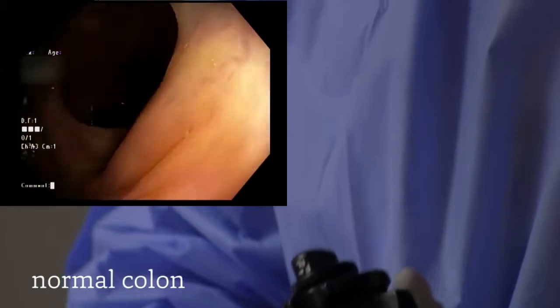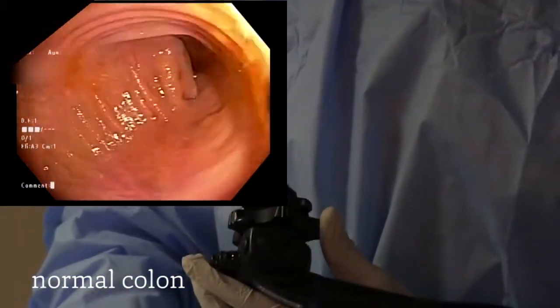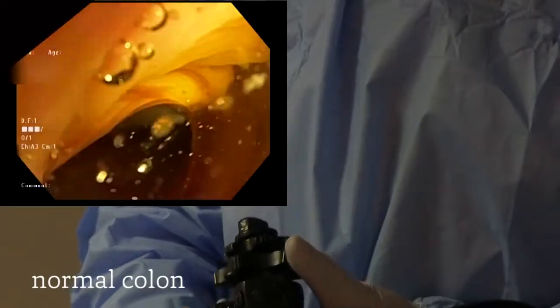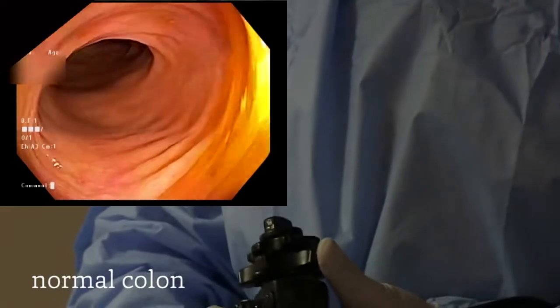We are moving from the ascending colon, now moving backward into the transverse colon. Again, still using that same pattern of clockwise movement to examine a 360-degree view of the colon.